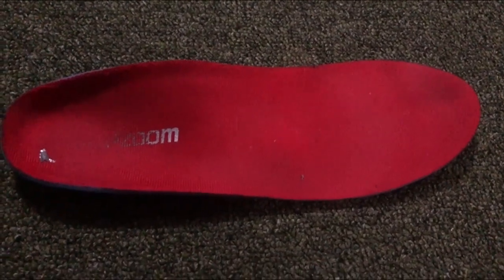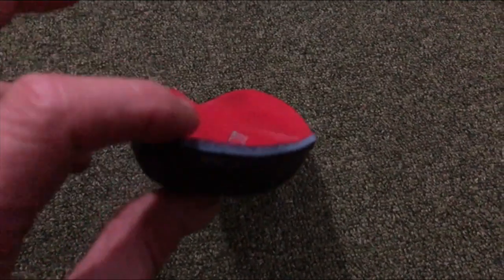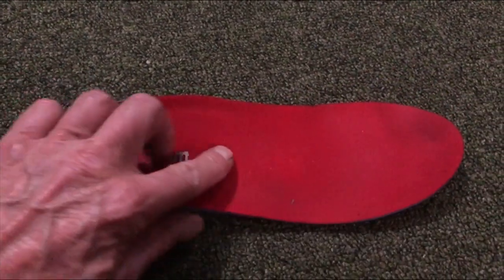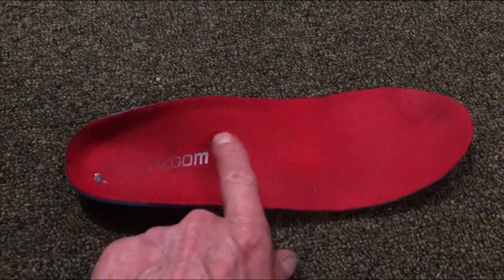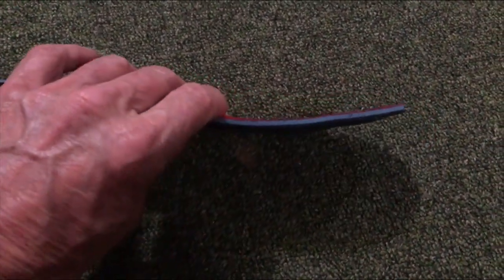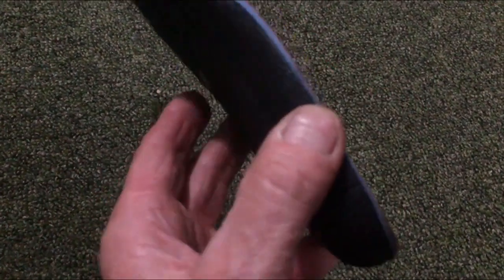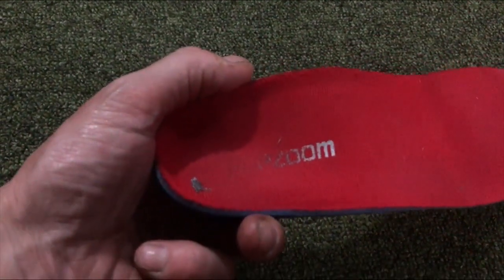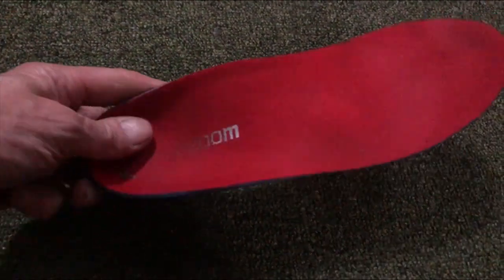When I run with it, it supports me very nicely. Let me show it from a few angles so you can see the shape. It's got good support where you need it, good support for your heel — nice and comfortable. It raises up nicely, then runs down and fits very nicely into your trainer. That's the Pop Zoom insole for plantar fasciitis.